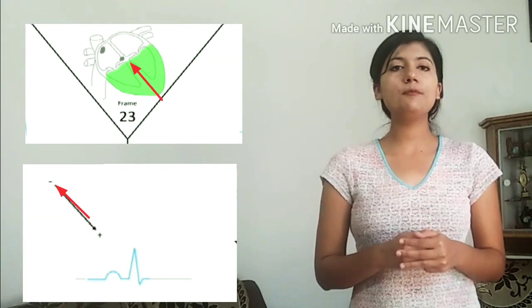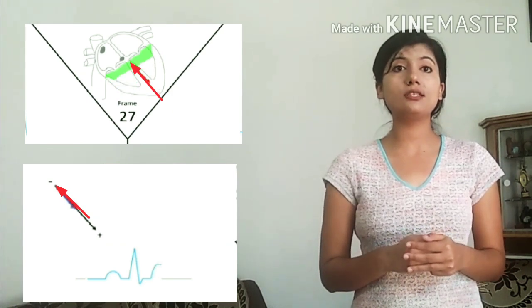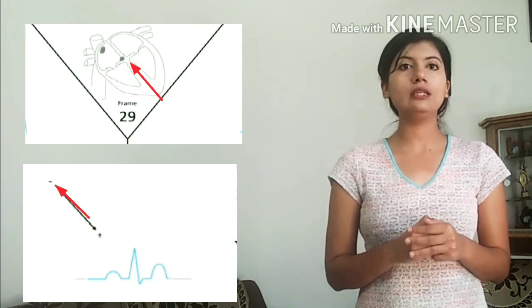And in case of repolarization, if the wave of repolarization is towards the positive terminal of that particular lead, then it will create a negative deflection, and vice versa.